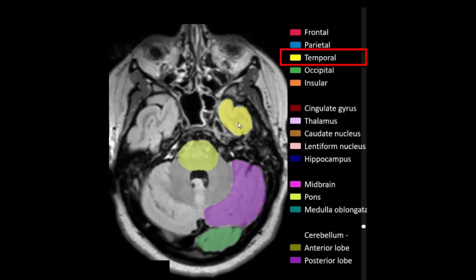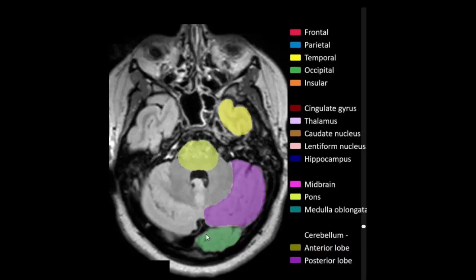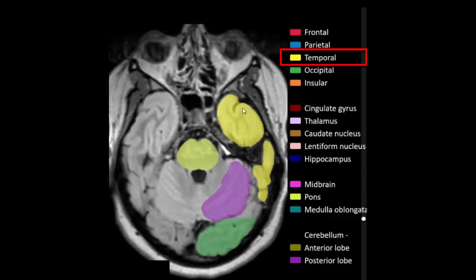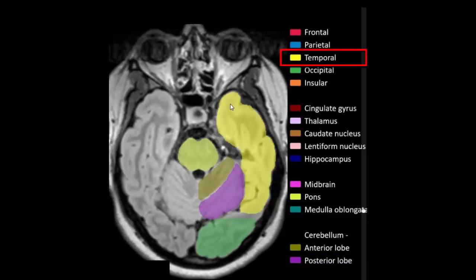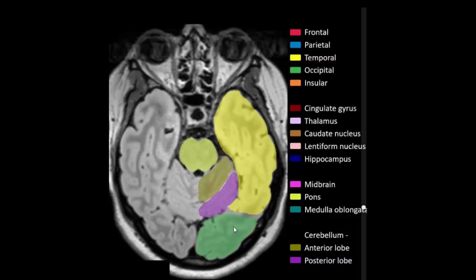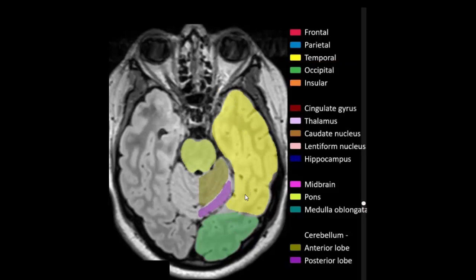Right and left temporal lobe, right and left posterior lobe of cerebellum. Occipital lobe. Right and left temporal lobe, anterior lobe of cerebellum, posterior lobe of cerebellum. Occipital lobe.